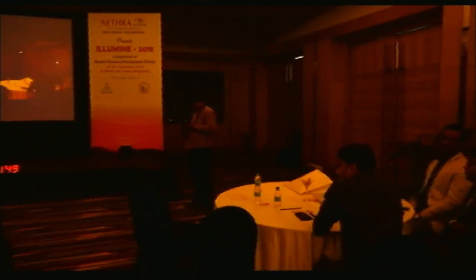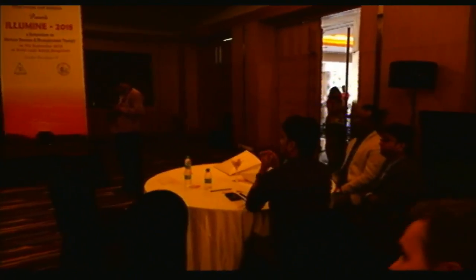It's an excellent case, and it shows a condition that is very disappointing to manage. The first case has a neovascular membrane and has the funny shape. The majority of the pure dome-shaped maculopathy will just show fluid on the apex of that curve and nothing else, and there's nothing you can do to get rid of the fluid. We've done several injections, no injections. We tried a lot of things, and if there's no neovascular membrane, you will have no effect whatsoever.